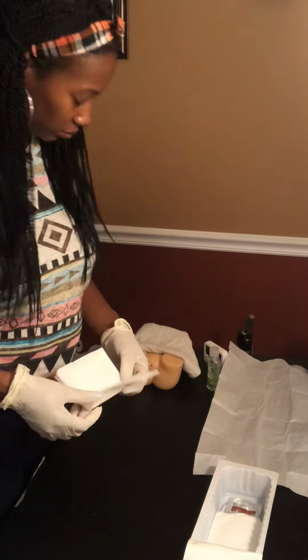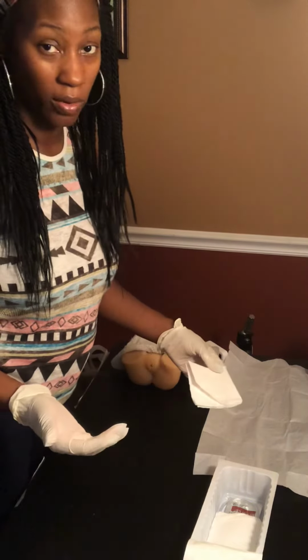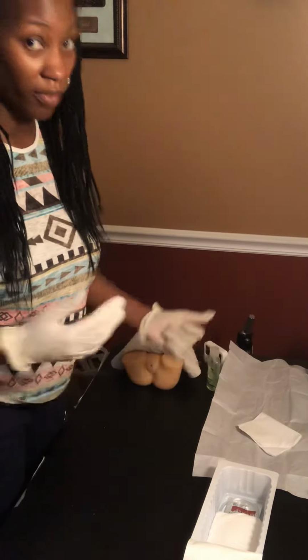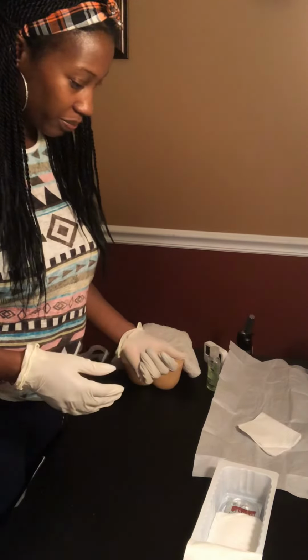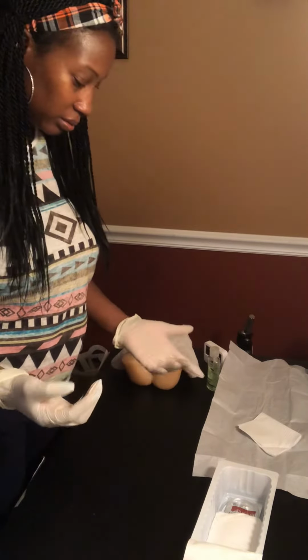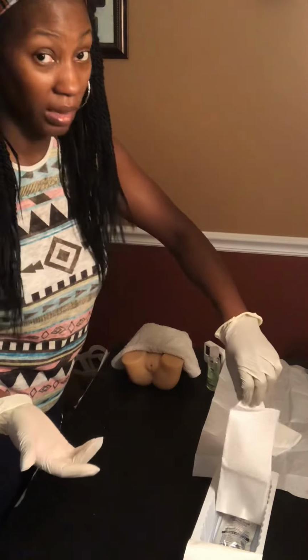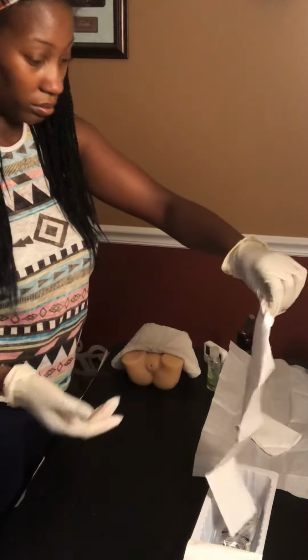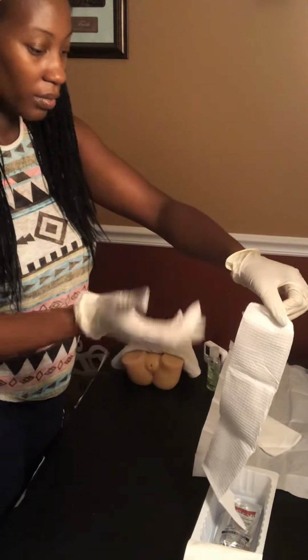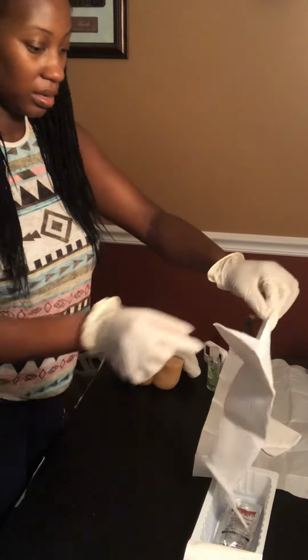I don't know if I failed or not because I didn't get the drape before I put on my gloves, but the drape wasn't at the top anyway, so I would have contaminated some stuff. So if you didn't have on your gloves, you would only want to touch the end.